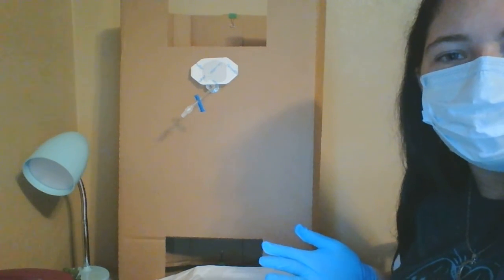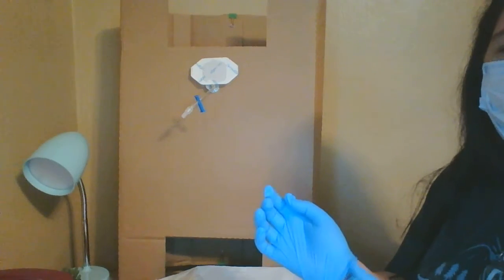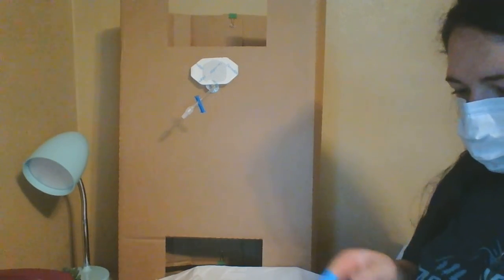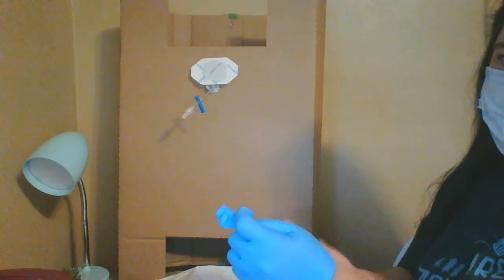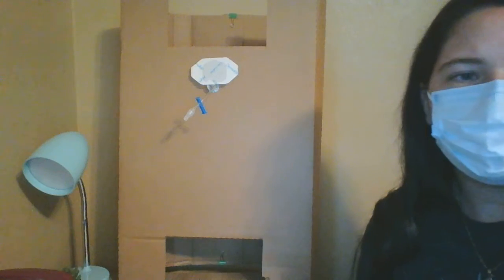I just need to clean up my area so I can take off my gloves. And kind of ball everything up in my sterile field and put it in the vial. And I also want to put a label on the dressing. I want to do hand hygiene.